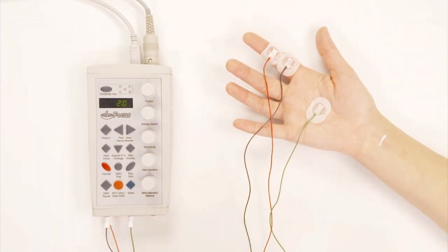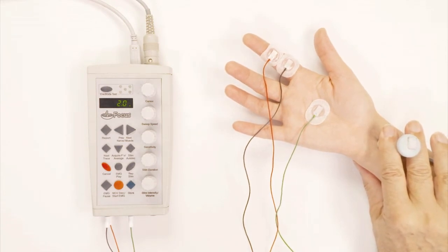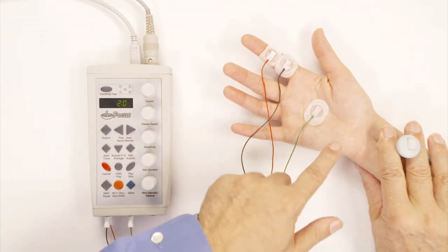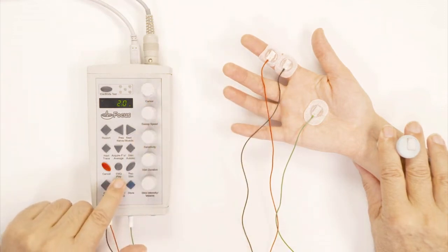So now we're going to stimulate the nerve. Okay. And in order to stimulate the nerve right here at the wrist, I'm going to press this orange button, which delivers the electricity. So because we're stimulating the nerve, the muscle is going to move and you're going to see her finger twitch right here. Here we go.